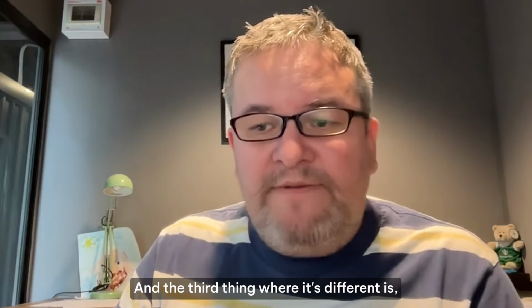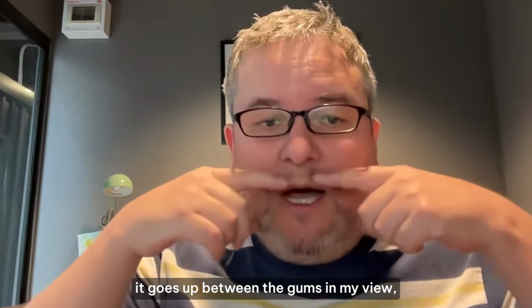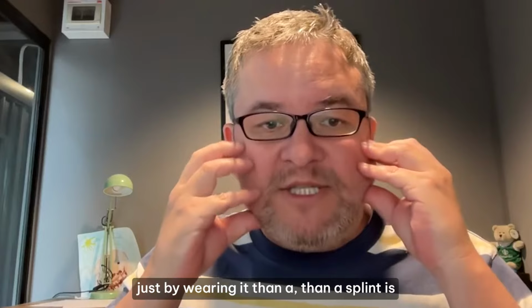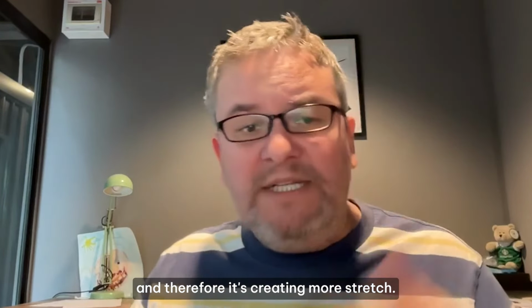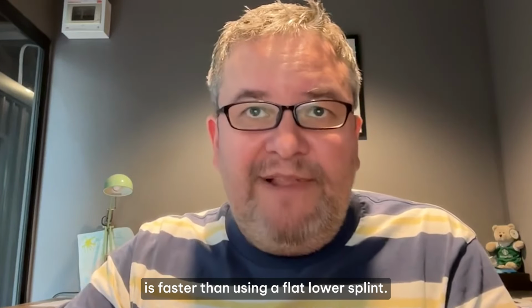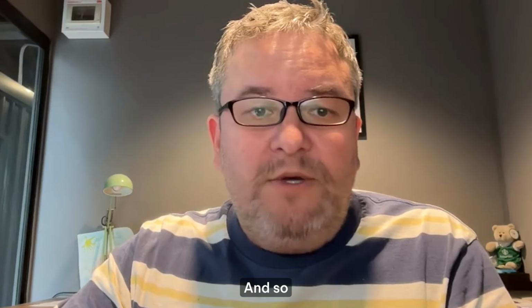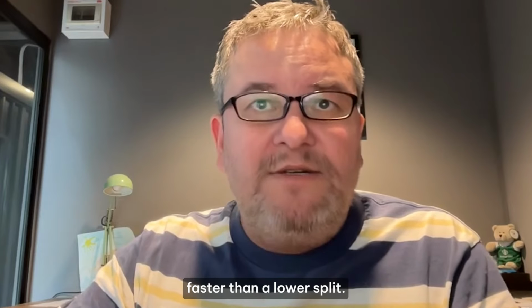And the third thing where it's different is a mouth guard where it's got upper and lower tooth channels, it goes up between the gums. In my view, it's engaging more muscles just by wearing it than a splint is, and therefore it's creating more stretch. So I've always found that using a mouth guard is faster than using a flat lower splint, and I used to use both quite a bit back in the day.